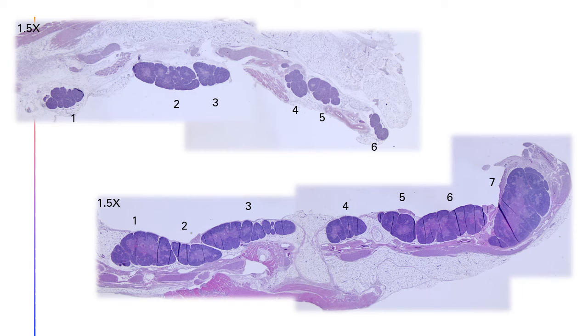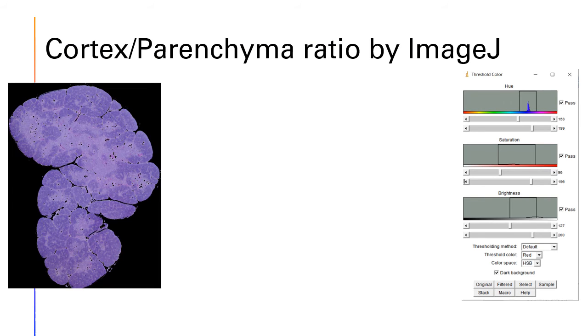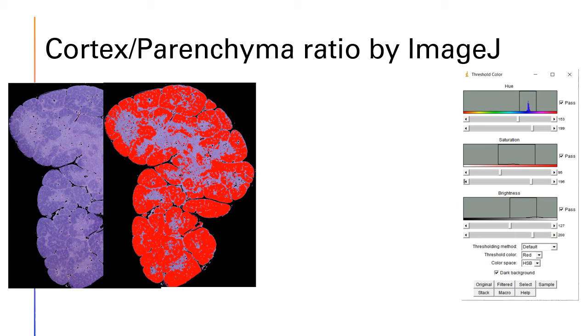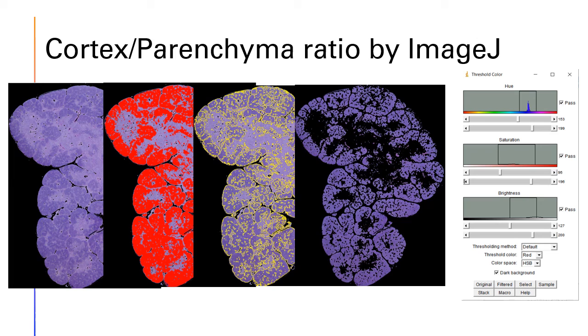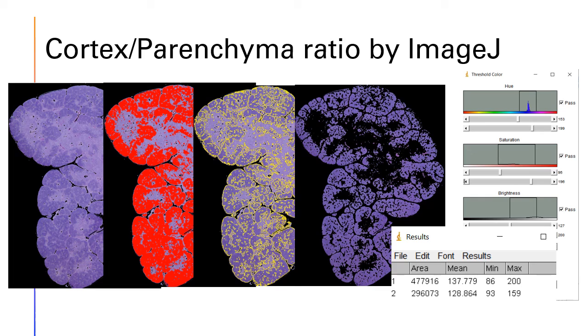To measure the thymus parenchyma and cortex size, a digital photograph of the histoslide at 1.x was taken. 2 representative lobes from one bird were picked and processed by the ImageJ program. Once the representative lobe was selected in the digital photograph, the color threshold function of ImageJ allowed selecting the total parenchyma as well as the cortex area. This is distinct from medulla. The range of color and its saturation are easily adjustable depending on the cellular density and the condition of staining. Area is measured by pixel, and the ratio was calculated by the Excel program.